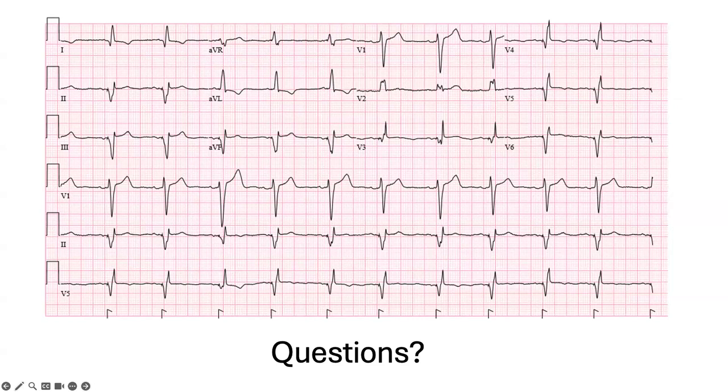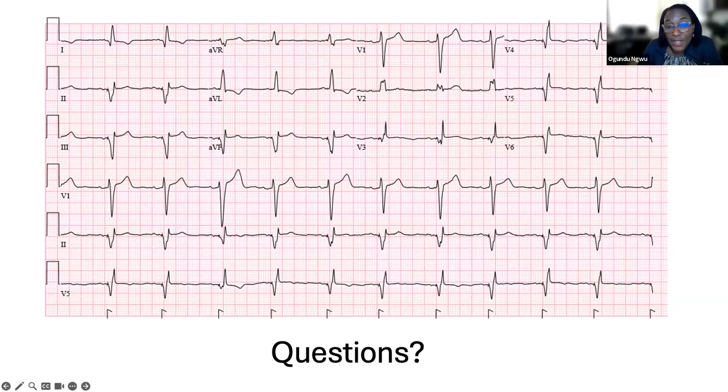You get that in very small cases. It doesn't happen very often, because obviously the higher the threshold, the more likely you are to get PNS. But it's always worth trying that: just reduce the pulse width to get past the diaphragmatic pacing, or neck stimulation. Okay, that's a good point.